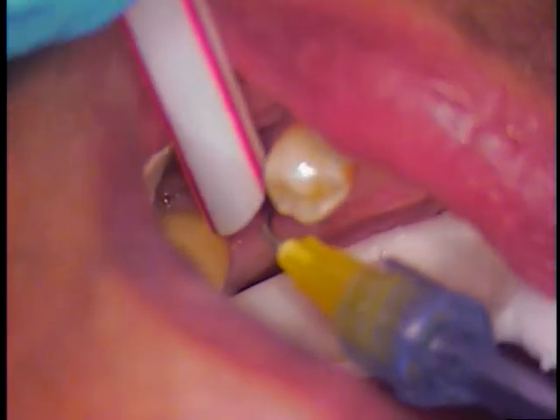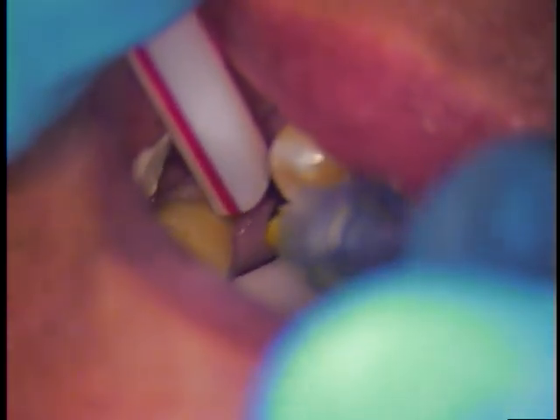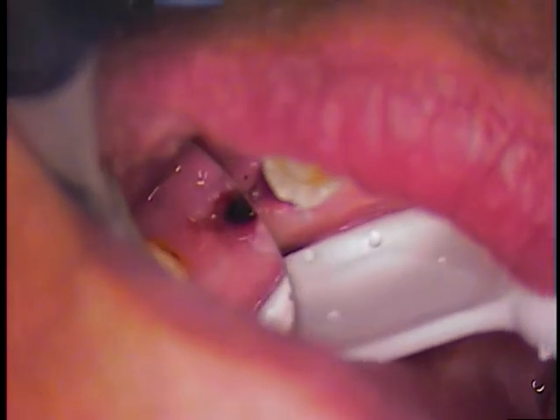Now, this is an air water. And now we just dry it off and switch back. And let's see what we have now. It should be fairly clean down in there. It is starting to collapse a little bit now, so we've got to work diligently. Here we go. Okay.